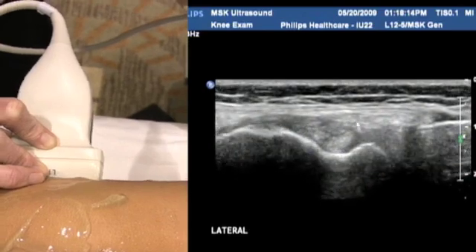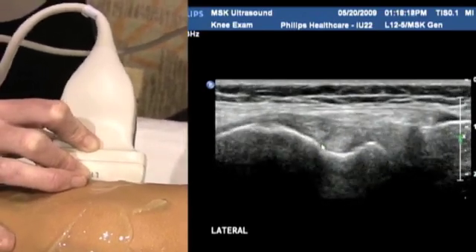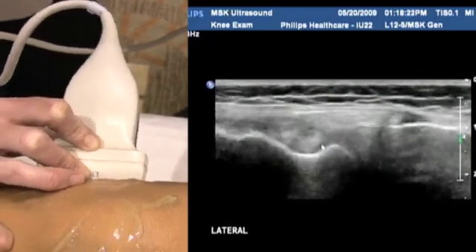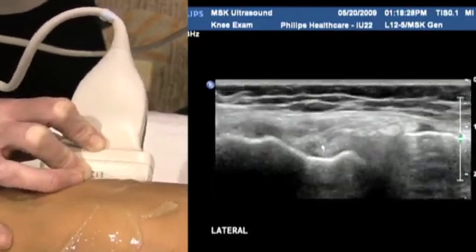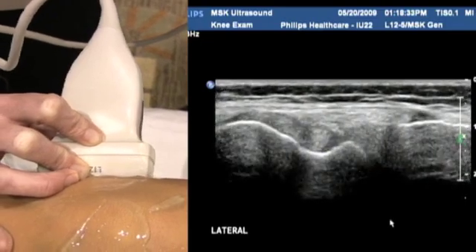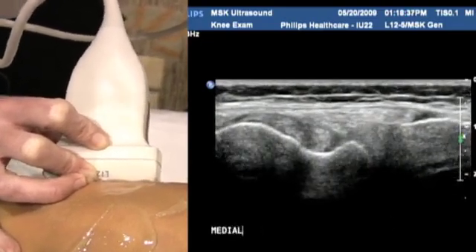You can see popliteus tendon down here. Again, it's quite round, quite echogenic, quite normal looking in this model, which is lovely. And again, I'm just assessing generally for fluid extending out of that joint. All right. So on we go medially.